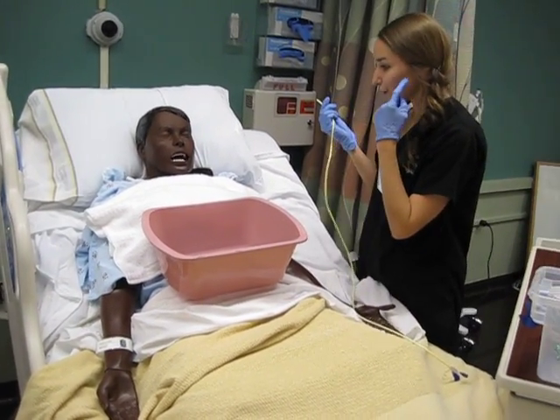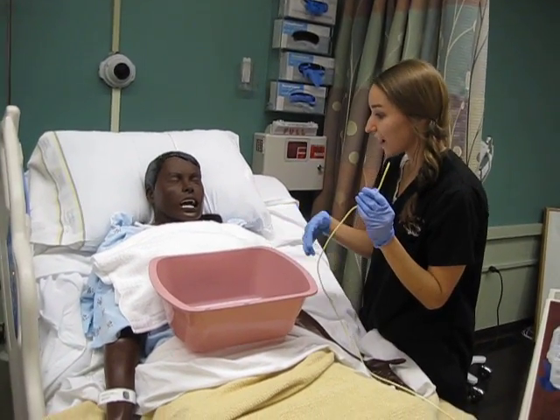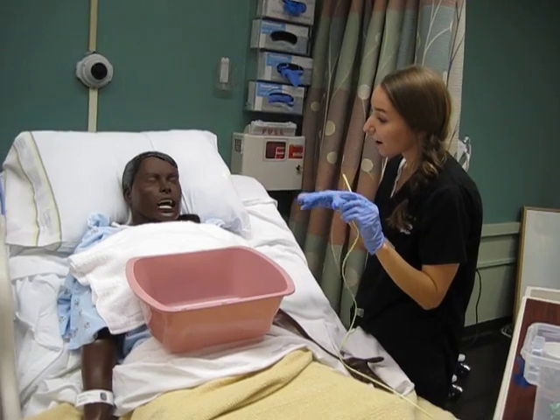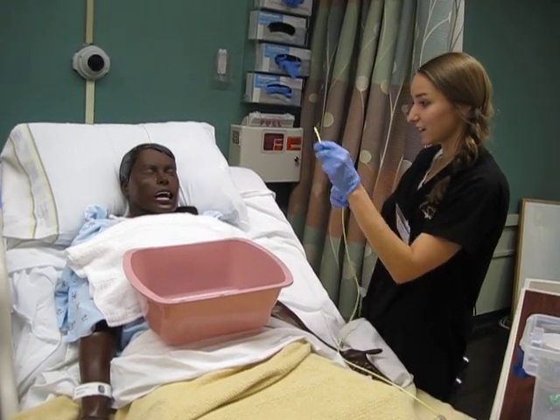The next thing I'm going to do is loop the tube up just so it will go in easier. And then once I get it to the roof of your mouth — once you feel it start to go in your throat — we're going to put your chin to your chest, and that way it will go down. I'll have you swallow as we go, and it will help it go down easier and faster.